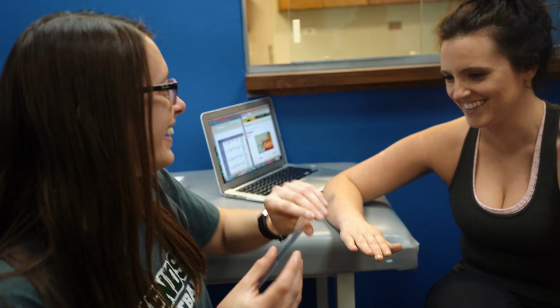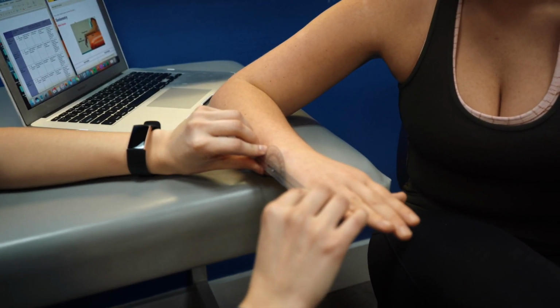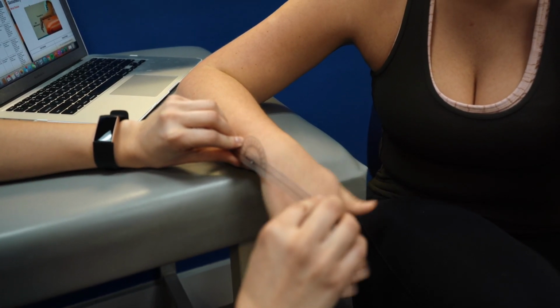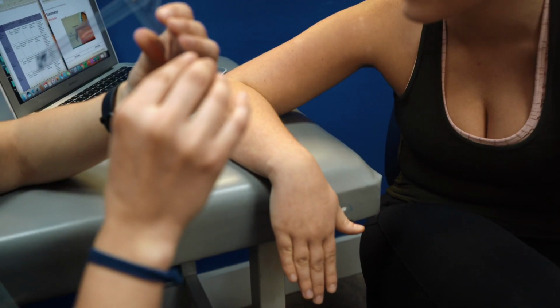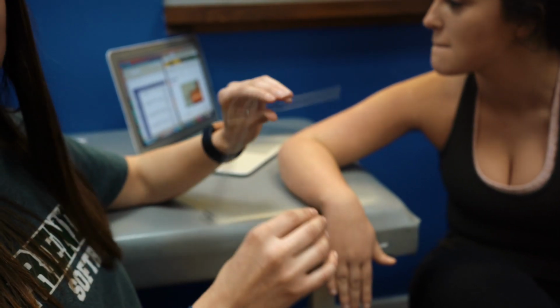Alright, so we're doing wrist flexion today, and make sure that the goni is sunny side up. So we're going to align the center of the fulcrum to the lateral triquetrum and flex for me. And we're going to align the moving arm to the pinky. And the range is 65, and that's within average.